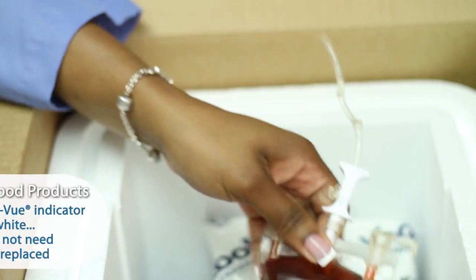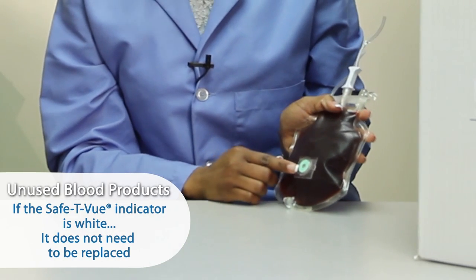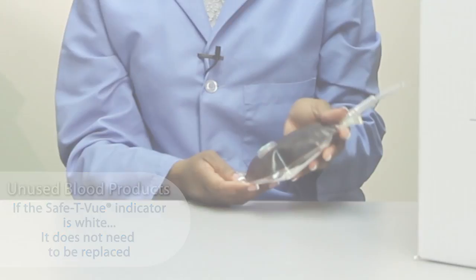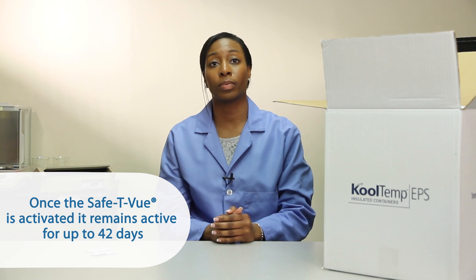When unused blood products are returned to the blood bank and the indicator is white, the indicator does not need to be replaced. Once the safety view is activated, it remains active for up to 42 days.